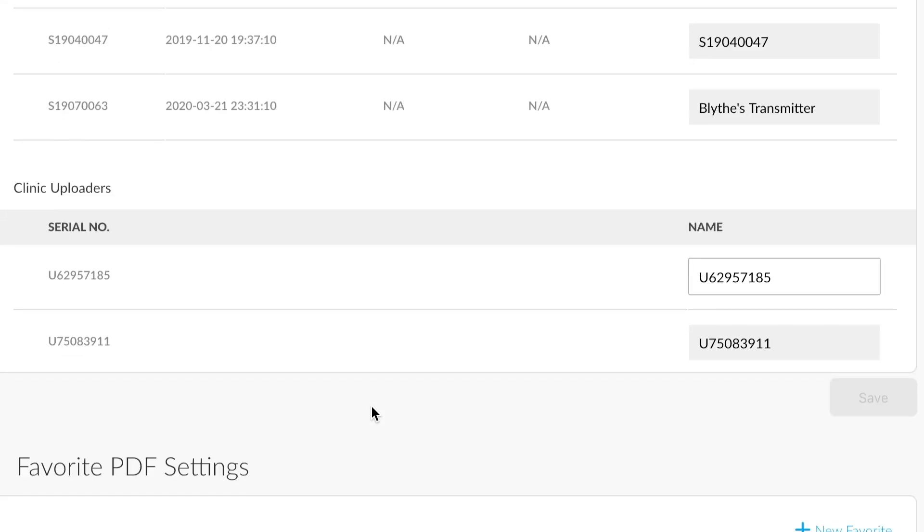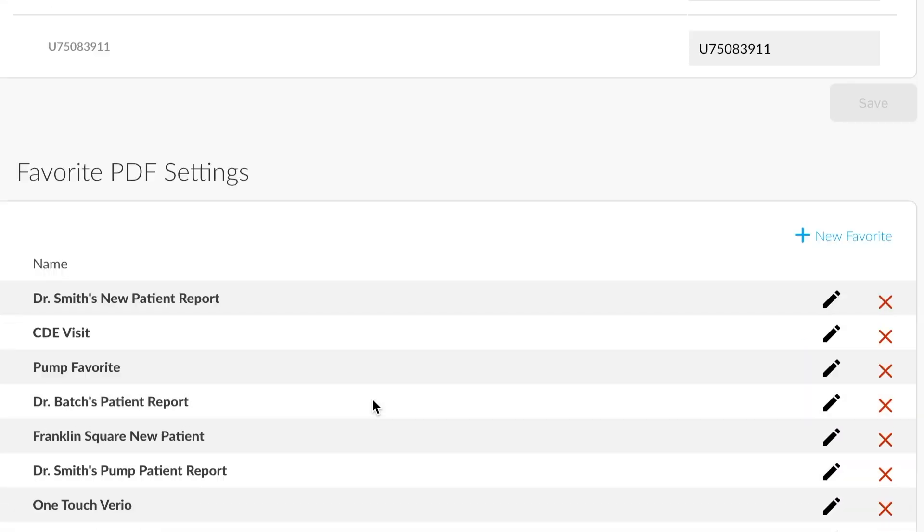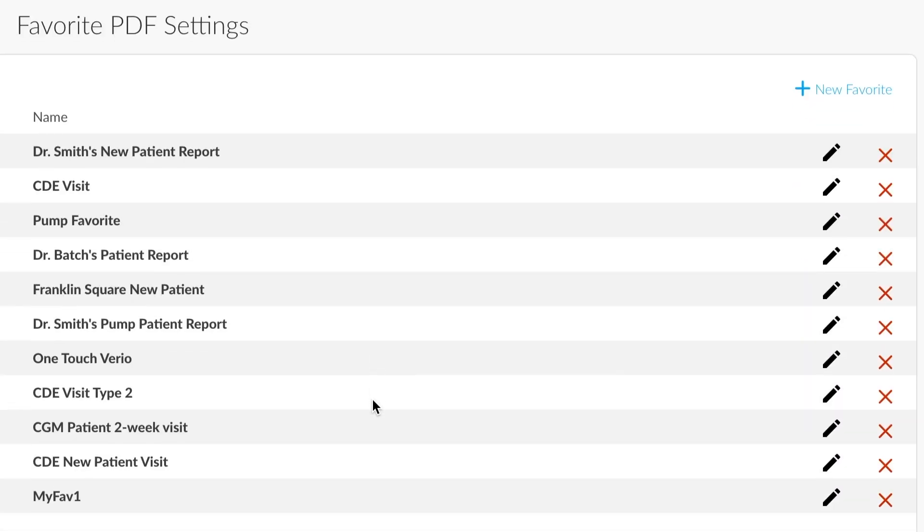Finally, scrolling down, we have our favorite PDF settings. This section allows us to modify our favorite PDF reports that we have saved over time. We could add a new favorite, we could edit one, or we could remove one.